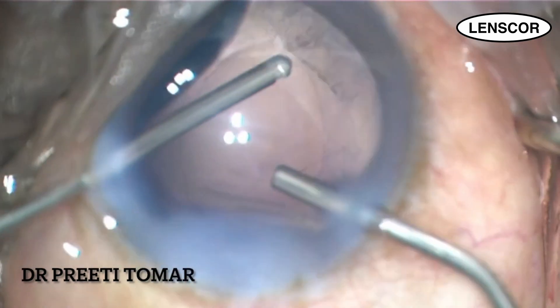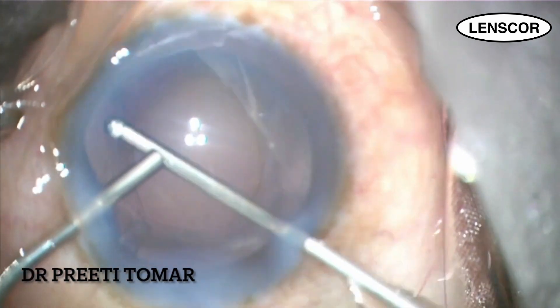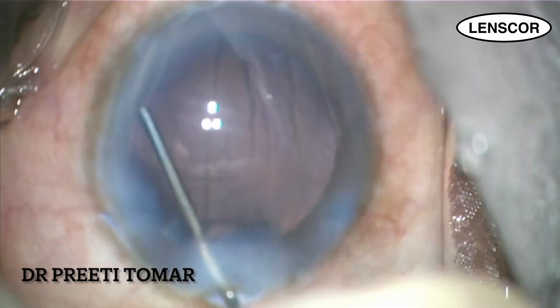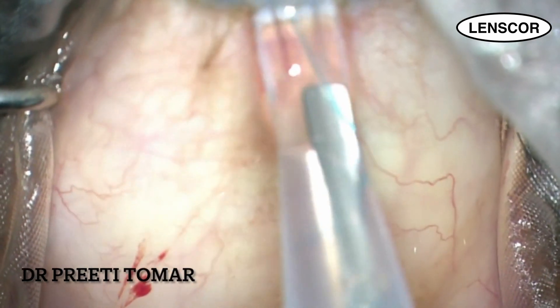Once the bag is free of all cortical fibers, I inject viscocohesive between the iris and anterior capsule to form an adequate sulcus space, which makes it easier to implant the multipiece IOL.